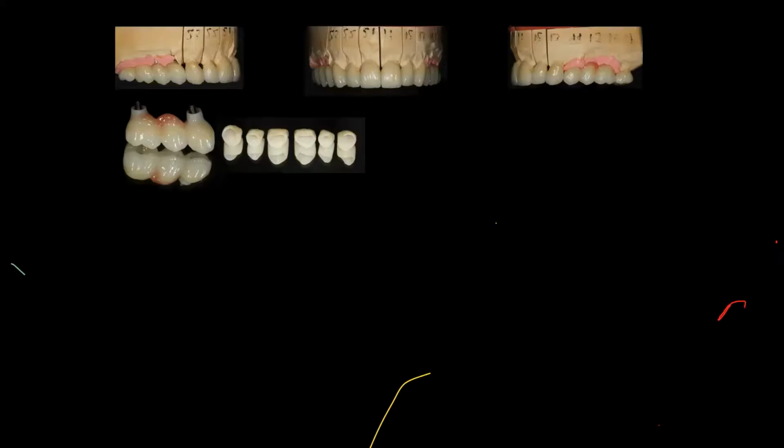Well, it's an interesting question. I'm going to answer you. I thought at the time, I really enjoyed the fully contoured zirconia. All the zirconia crowns are fully contoured right to the labial edge, and then it's cut back and then Emax type of porcelain added to it. So it's like a layered porcelain that gives you that nice natural effect. And there's no reason why we could not have done this with metal ceramic crowns. So I mainly did zirconia crowns because I had the posterior bridgework to match with. And that was my aim.